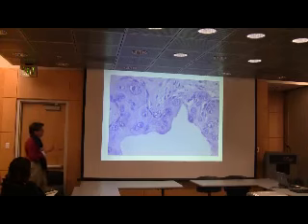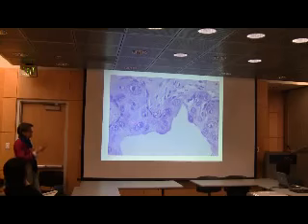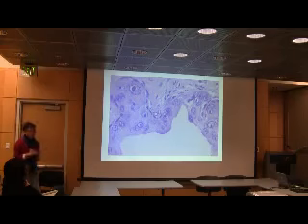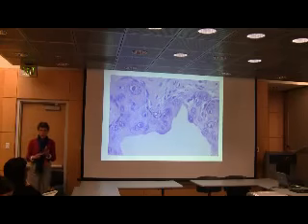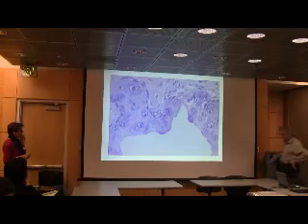So here's an example of a very close-up view of high-grade DCIS. The basement membrane is still intact, running along here, and these are very large, very abnormal, very high-grade type cells, still carcinoma in situ. Want to say something about that?